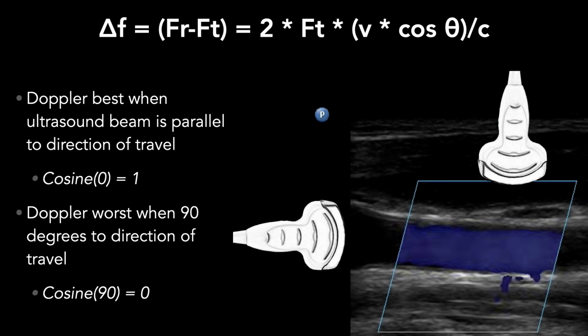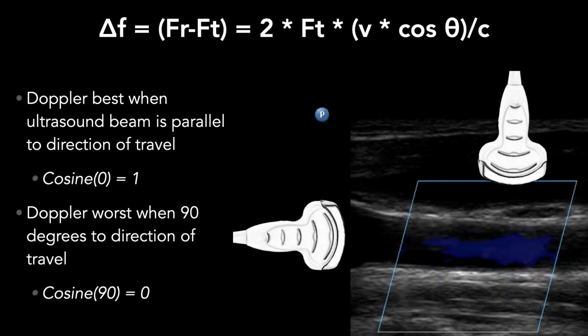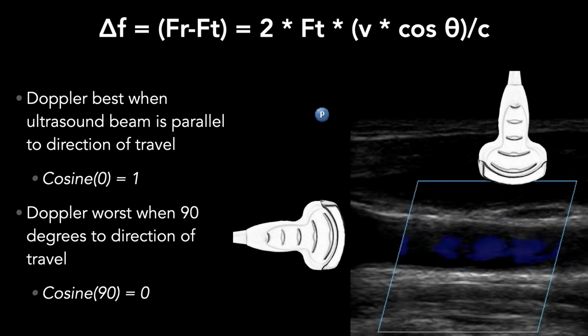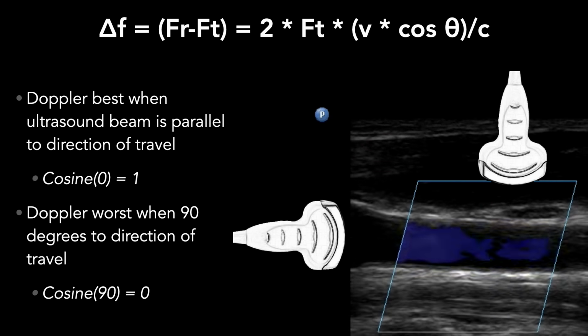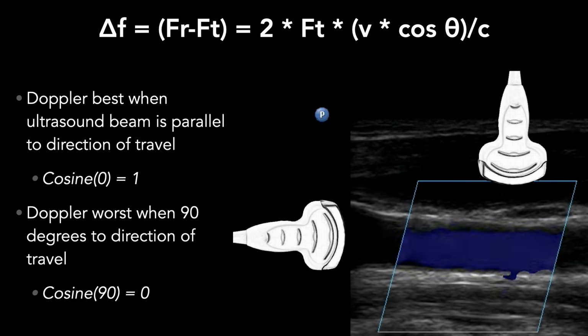So think about it this way. If you are observing this train as it goes by, and your only field of view is what's immediately in front of you, perpendicular to the train tracks, and you happen to snap a picture of it, you cannot tell whether it's moving forward or backwards. It's perfectly still.